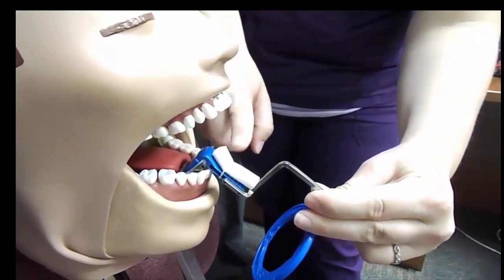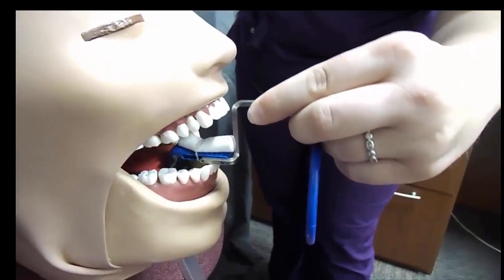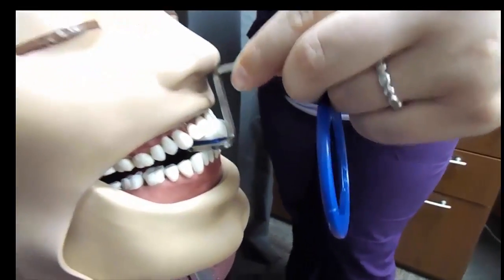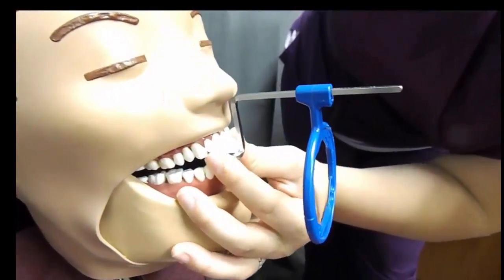Never have the incisal edges resting near the film or on the film — always at the end of the bite block. This will ensure that you're parallel to the true axis of the tooth. Once you have it positioned, have the patient bite down.